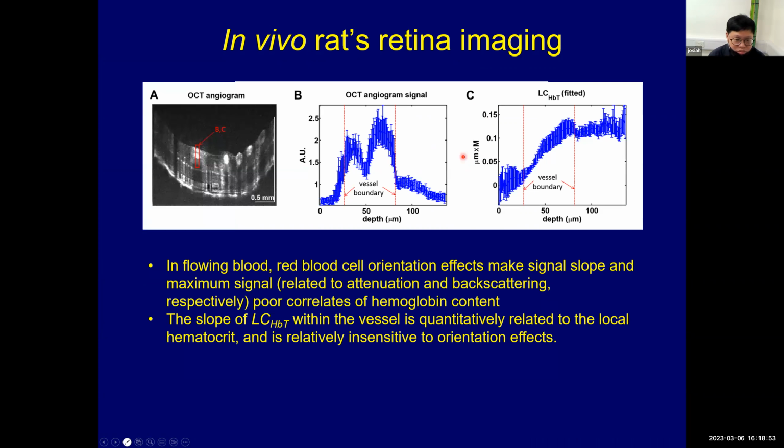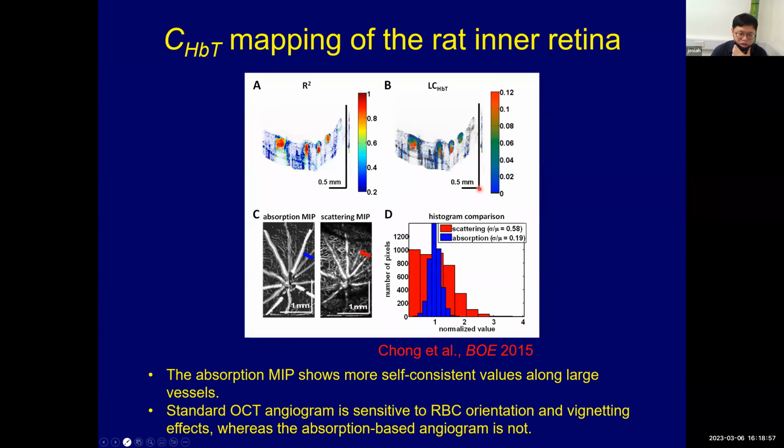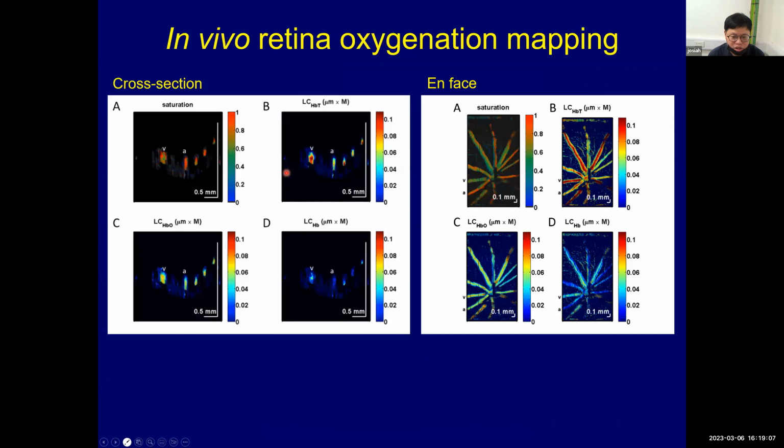From this, we can fit the concentration of the blood in the retina, and we can also get the oxygenation from the retina in the same approach.